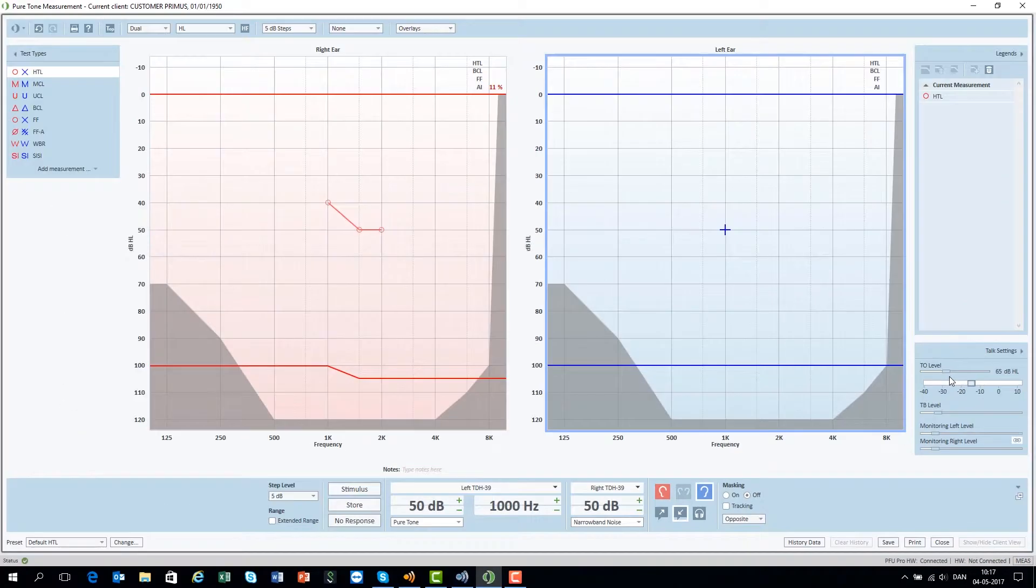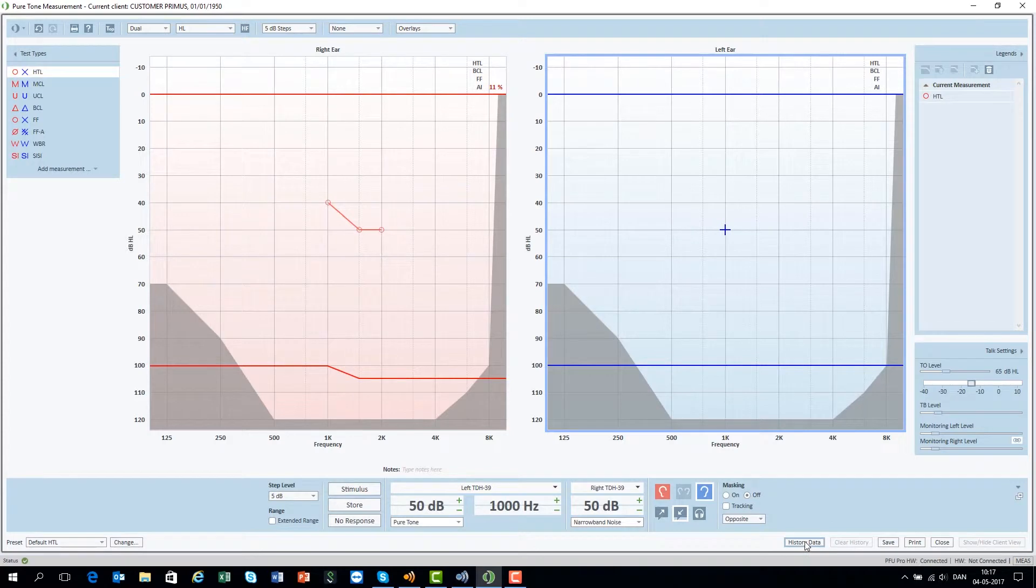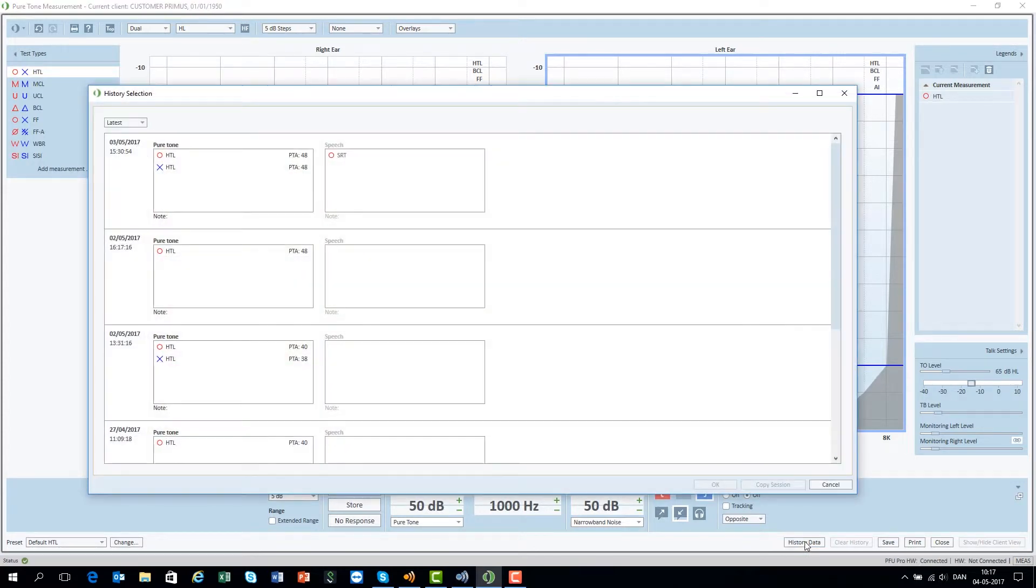Slightly above talk settings, you find Legends, where you can select the test data to be displayed on the screen. In the history settings, you can easily compare previous audiograms with the current one.